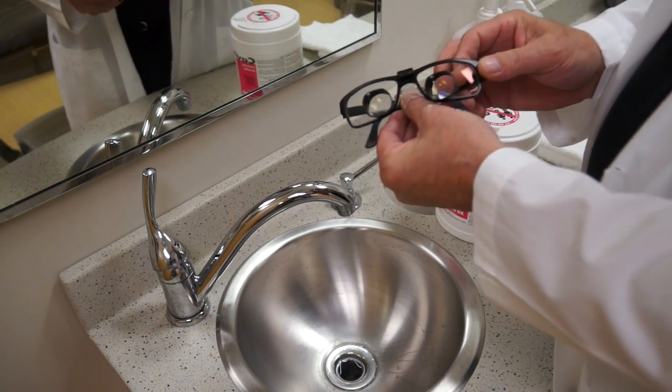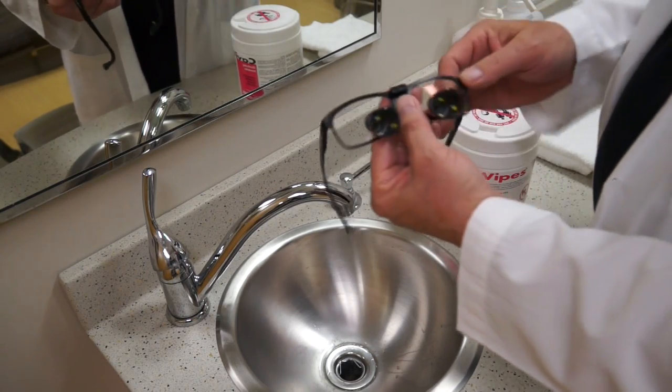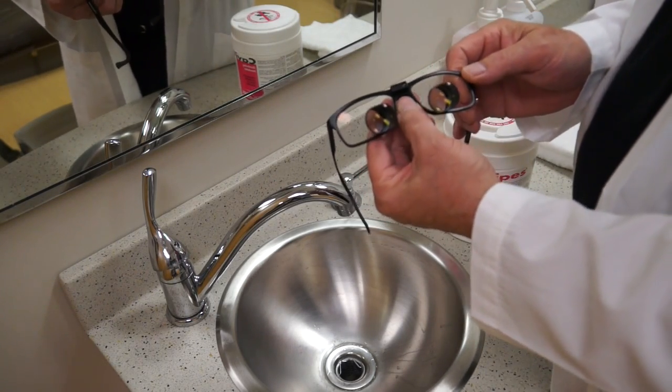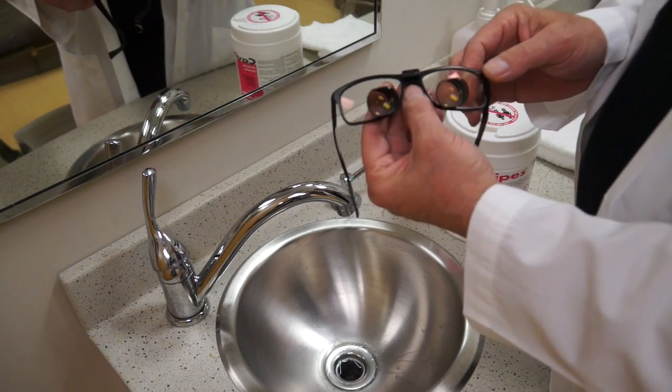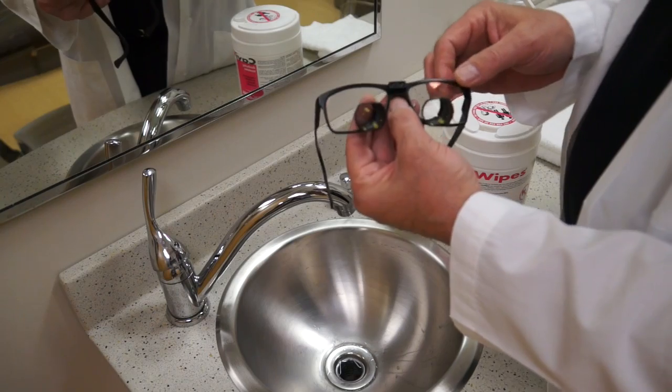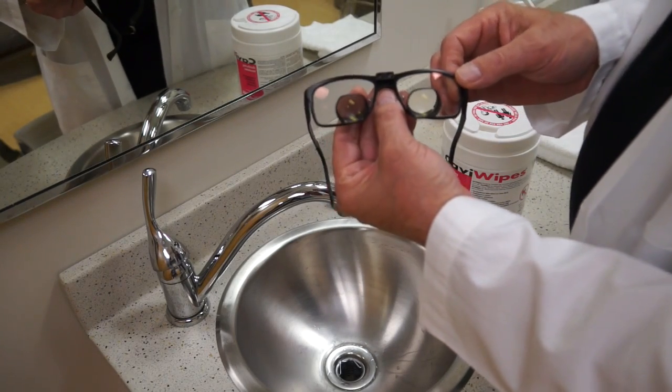Cleaning your Orascoptic loops using either a Cavicide Wipe or, if you have alcohol available, isopropyl 70% is best. 90% is a bit harsh on the glues that we use to adhere the oculars into the frame.